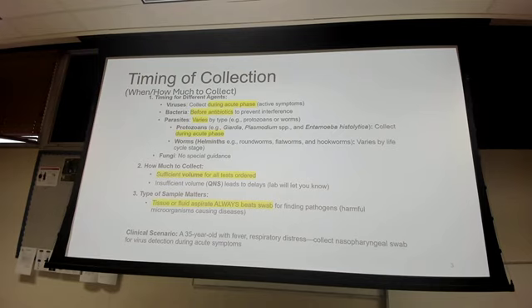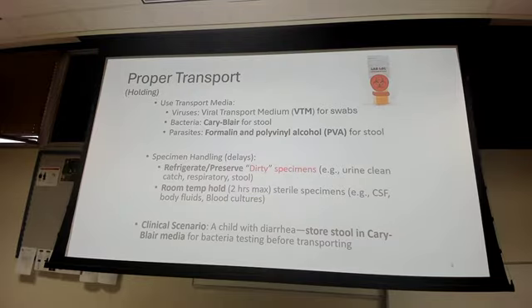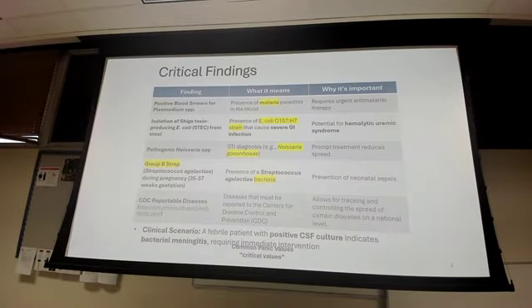All right? And so, if you are collecting a virus, when do you want to collect them? Correct. And for bacteria, before or after antibiotics? Before. Ooh. Proper transport. How do we transport the stools? In a Cary-Blair transport container.